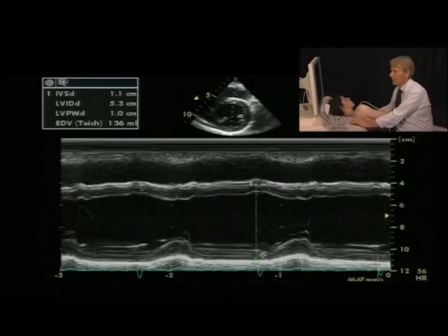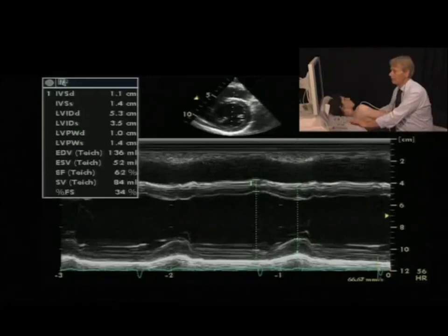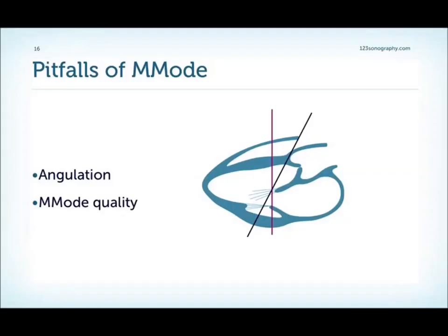Now all these measurements are in diastole, and you would then perform the same measurements at systole for the end systolic diameter and for the posterolateral wall. These are basically the measurements that you would perform. Be careful when you perform M-mode measurements of the left ventricle.